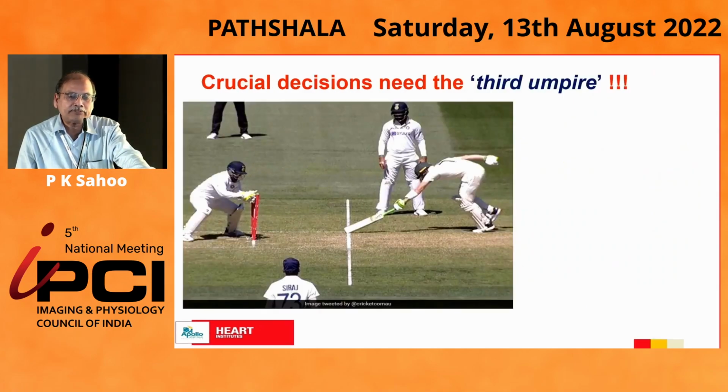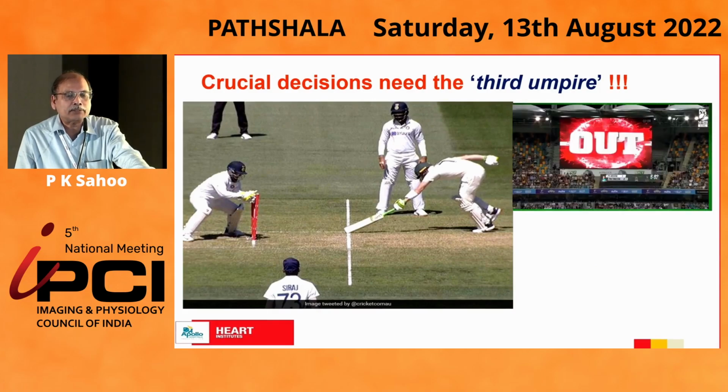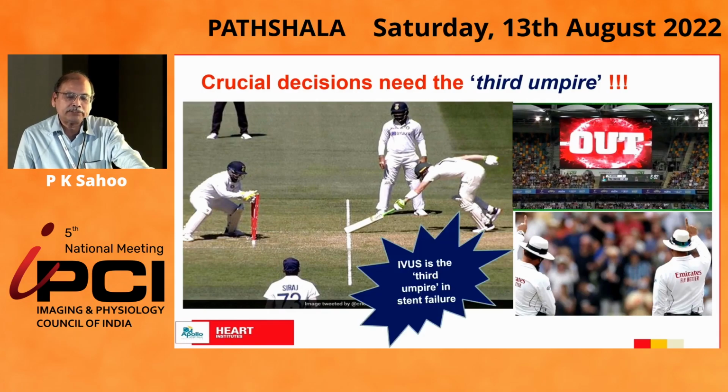So what is the role of IVUS? It is like the third umpire, which finally tells you whether this player is out or not, and that is where we say IVUS is the third umpire in stent failure.